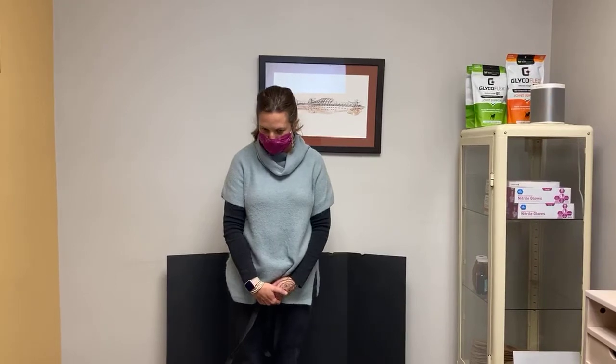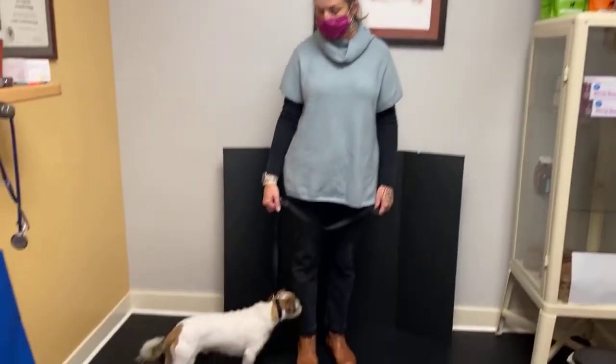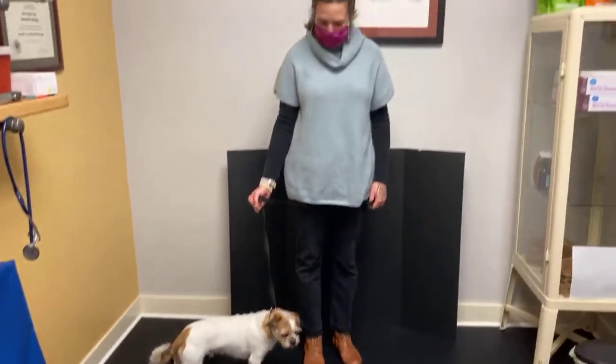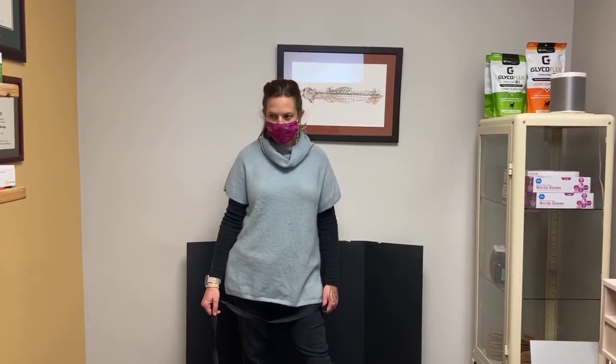Hi there everybody, I'm Dr. Beth Innes and today I have with me my trusty rascally sidekick Andrew — this is my own dog from home. He's going to help me demonstrate how we use the digi-therm machine, which is a way to use thermography, or a heat camera that detects heat, in order to help zero in on pain and inflammation.